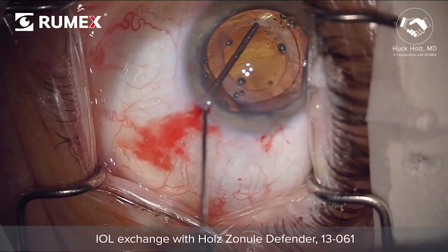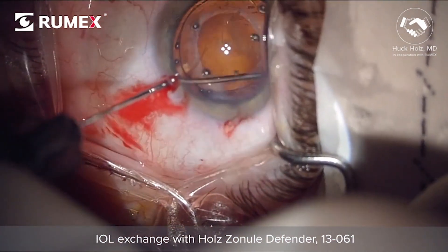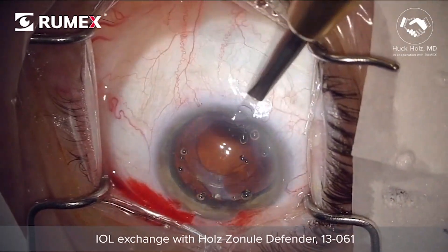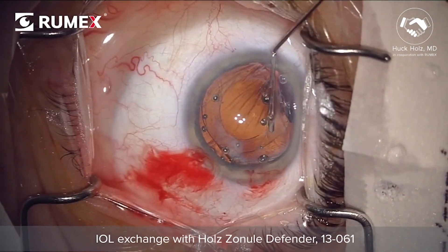This lens has been in situ for over 7 years and is being removed for positive and negative dysphotopsy complaints. The capsule rim is very fibrotic, so it is going to be first trimmed with micro scissors.